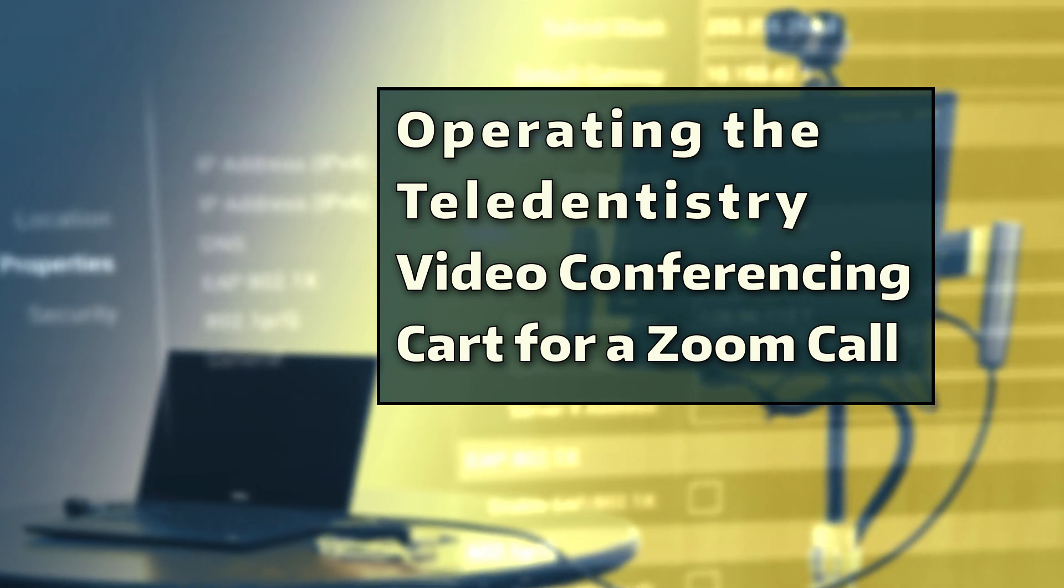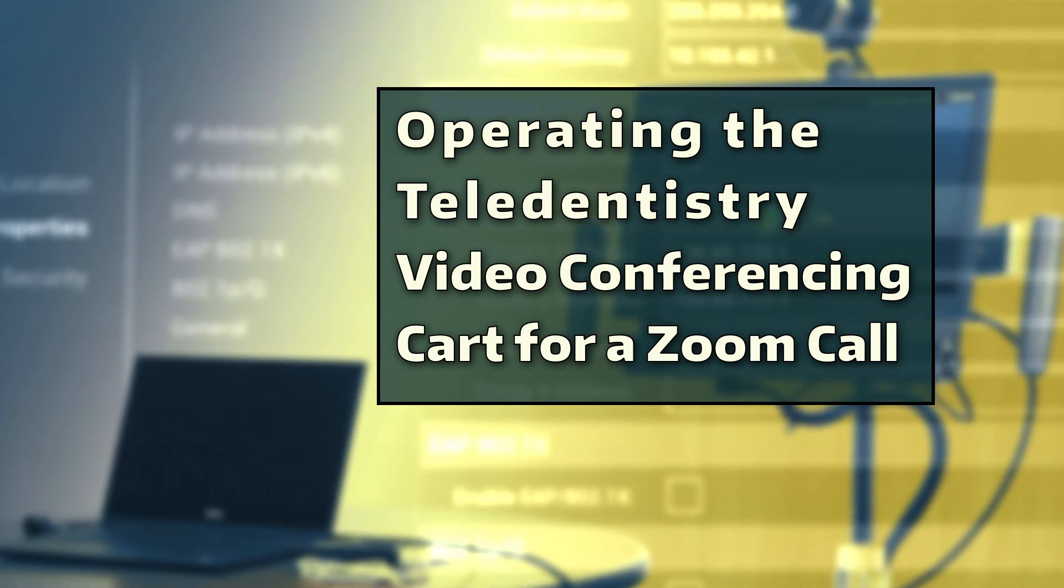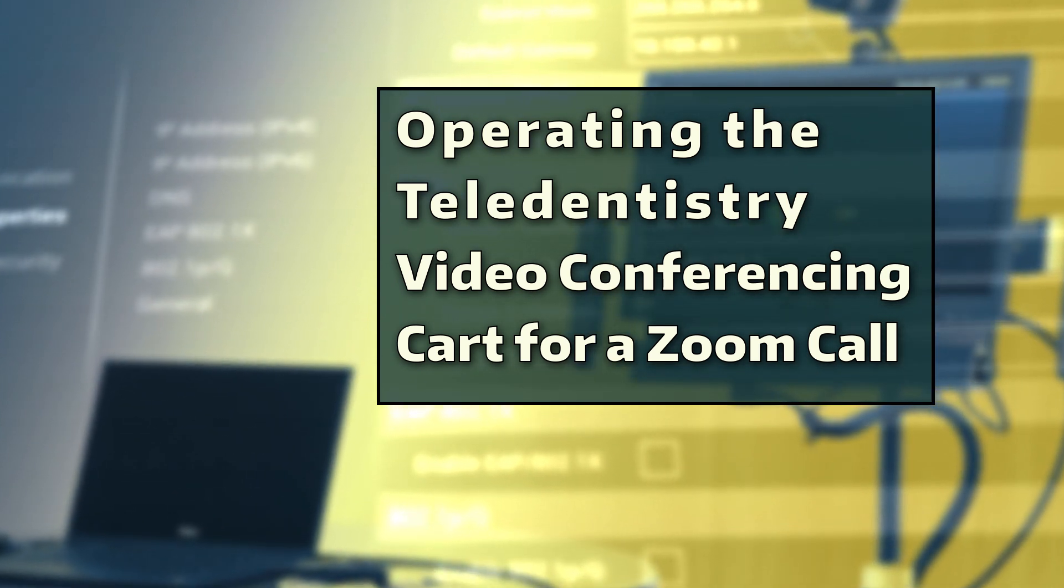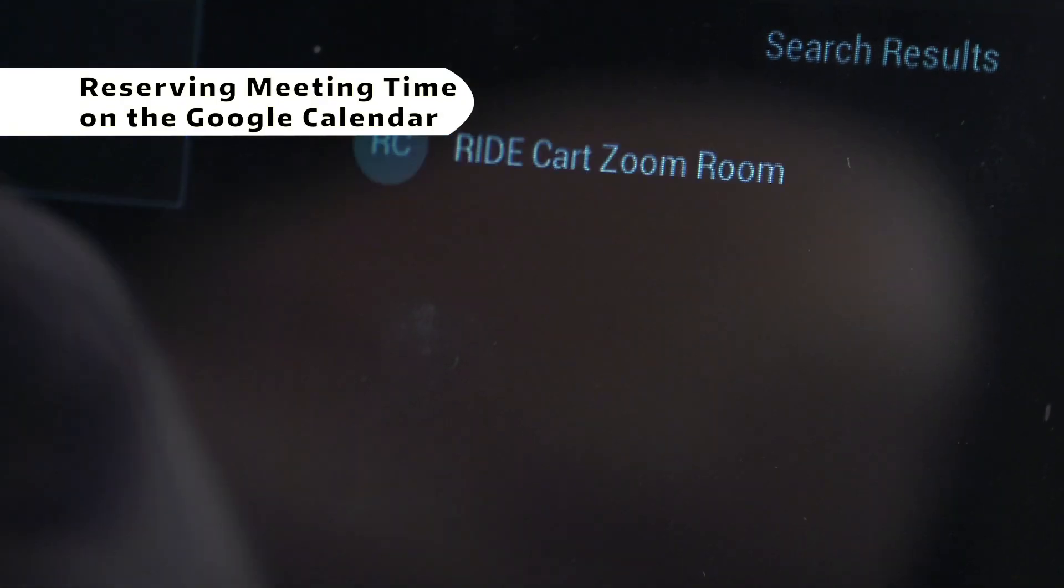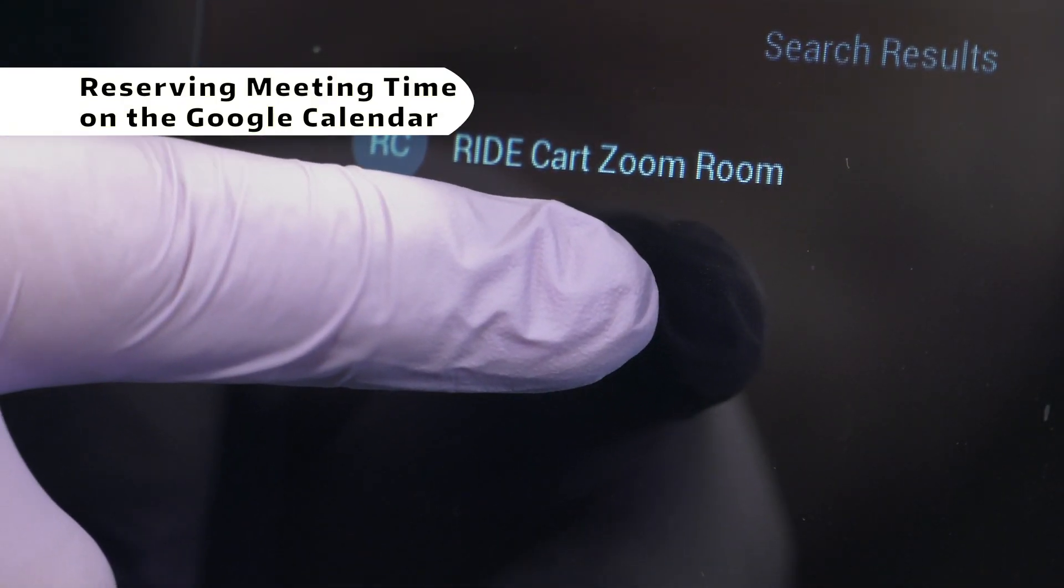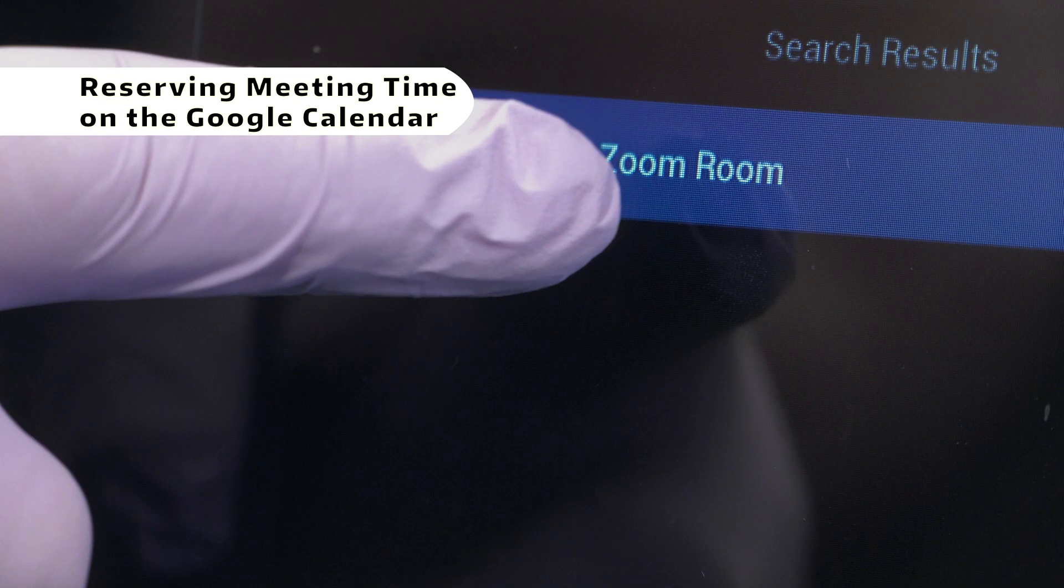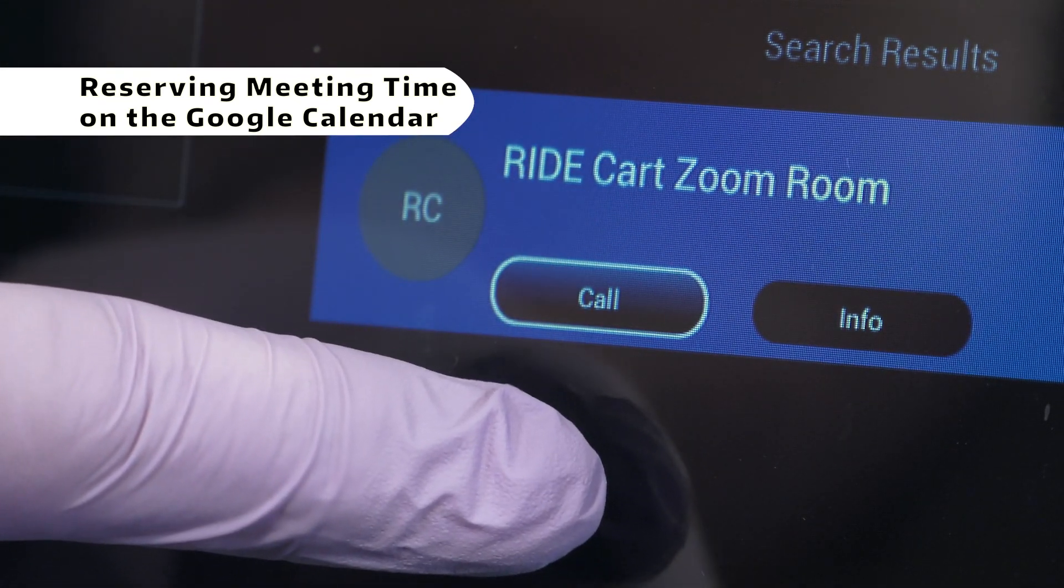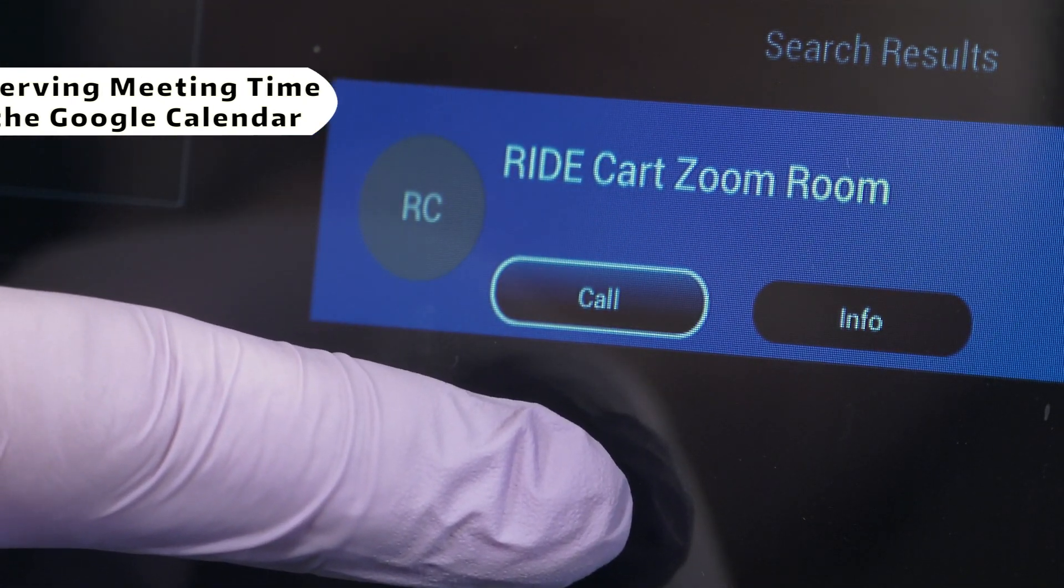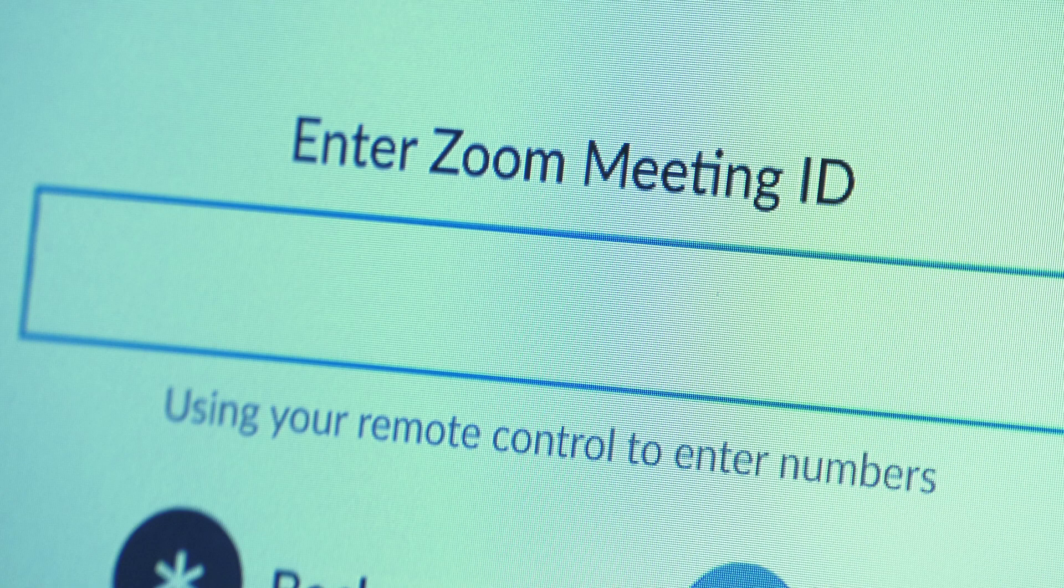Operating the teledentistry video conferencing cart for a Zoom call. The University of Washington School of Dentistry ride program has purchased a Zoom meeting ID specifically for clinical partners to use for teledentistry. This Zoom number is shared with all teledentistry cart recipients.